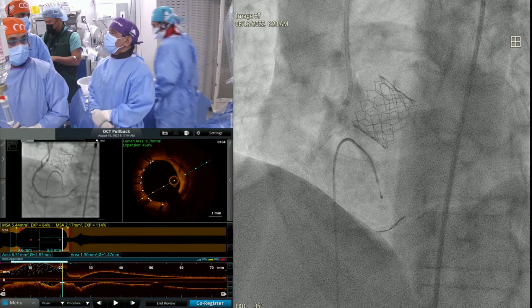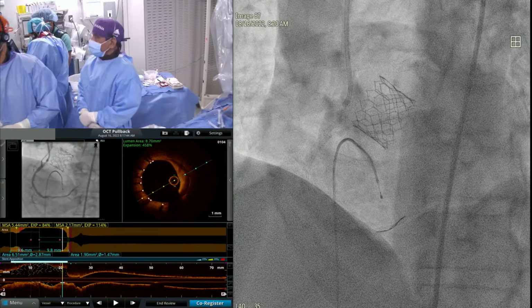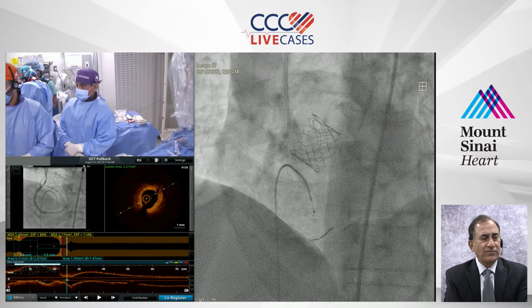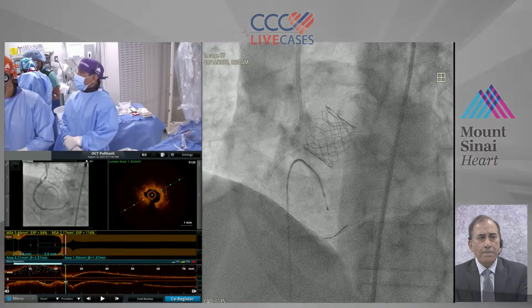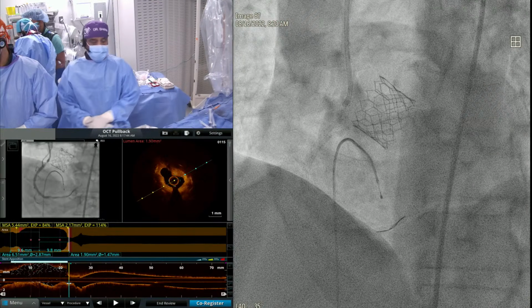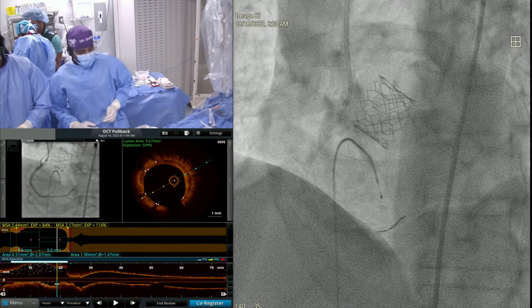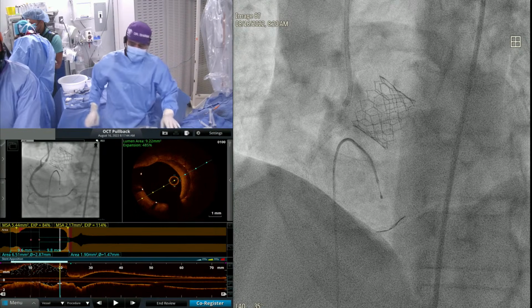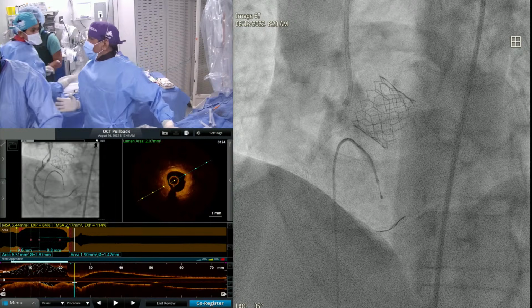Yeah. I'm going to lean on my expertise with the laser again. Haven't done a laser case in 20 years, but why a 1.4 and why not a larger one? So 0.9, 1.4. The other one we don't even have a setup for here, because that is more for EP, the 1.8 or 1.9. I don't know what size that is. But clearly 0.9 is what we usually use for a crossing, and then we can go to 1.4.